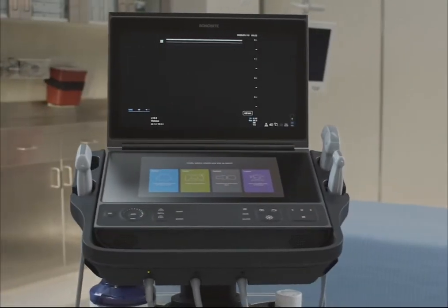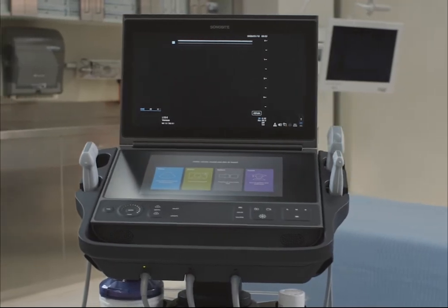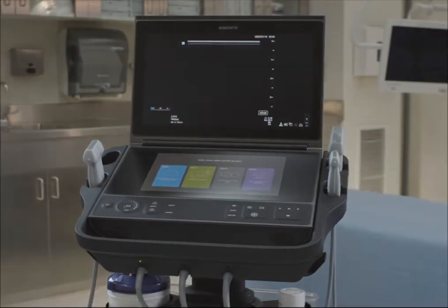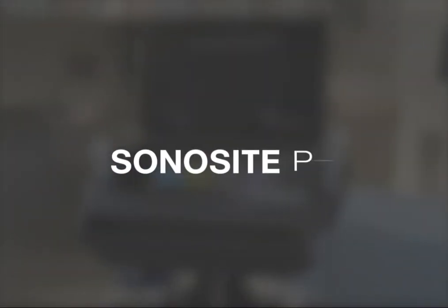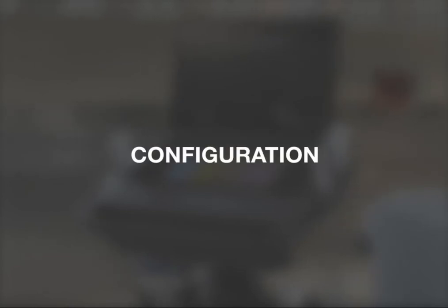Welcome to the Sonosight PX Help video, Configuration. In this video, we'll show you how to access system settings and make common configuration changes.